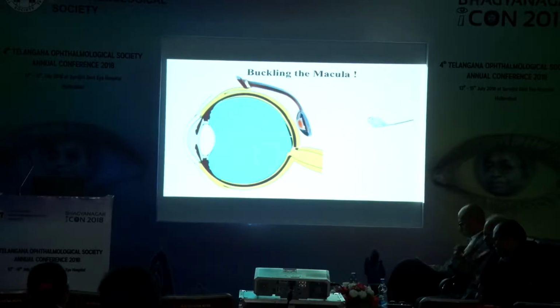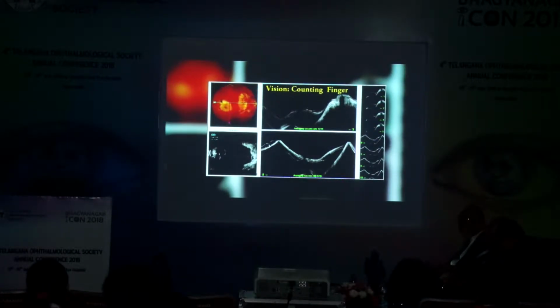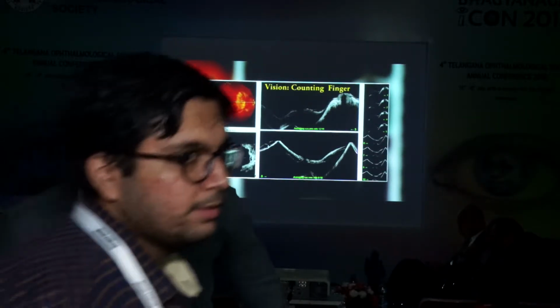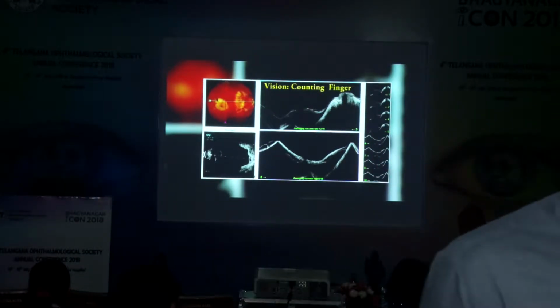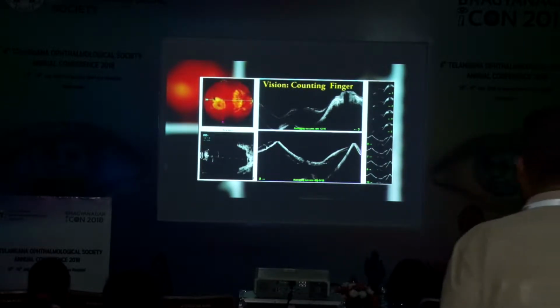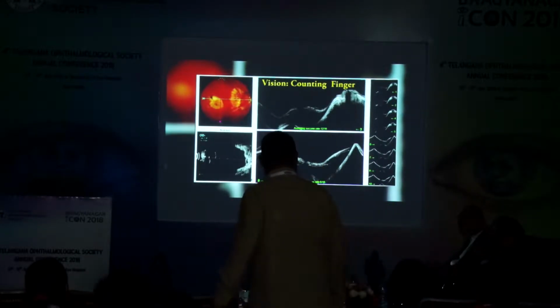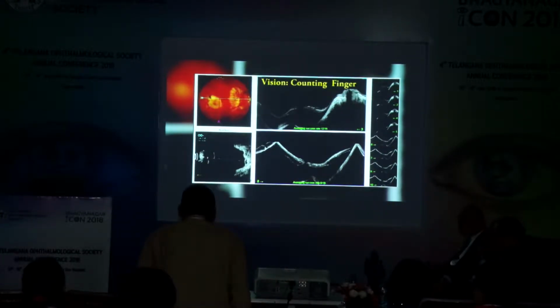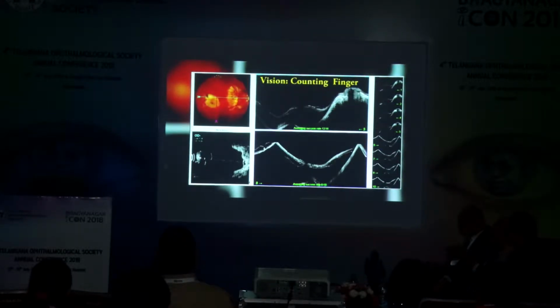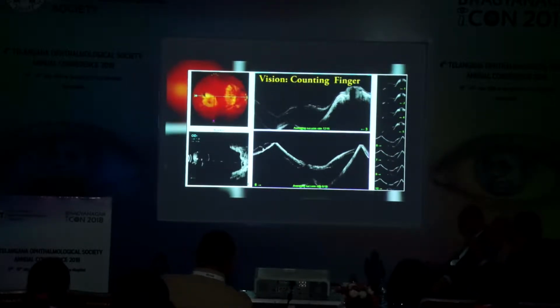Our patient was a 51-year-old gentleman with decreased vision of 6 months duration in the right eye. His best corrected visual acuity was counting fingers in the right eye and 20/80 in the left eye. The right eye axial length was 30.81 millimeters. His anterior segment examination was normal in both eyes. Posterior segment examination showed a macular hole with associated posterior pole retinal detachment and posterior staphyloma in the right eye. Also, the OCT images confirmed the presence of a full thickness macular hole with retinal detachment.